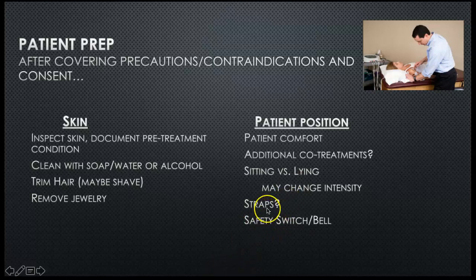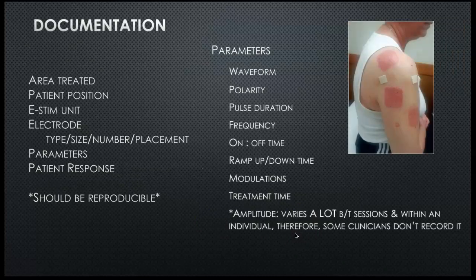You might need straps to hold electrodes on. And you always give your patient the safety bell or a switch so they can alert you or turn off the unit themselves safely if something is not feeling right.